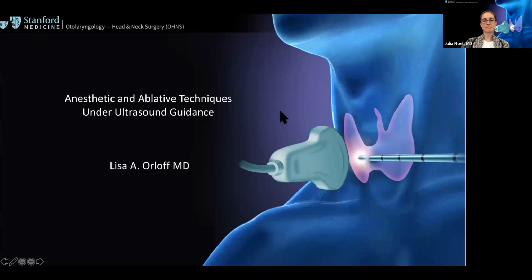Okay, thank you. And I would just reiterate that the ability to preserve thyroid function can't be overstated, how important that is. The fact that this is scarless, that there's no downtime, that it's relatively painless, and that it has relatively rapid results is, I think, superseded, or just expanded, by the fact that the avoidance of thyroid hormone replacement and preservation of normal tissue is so important.